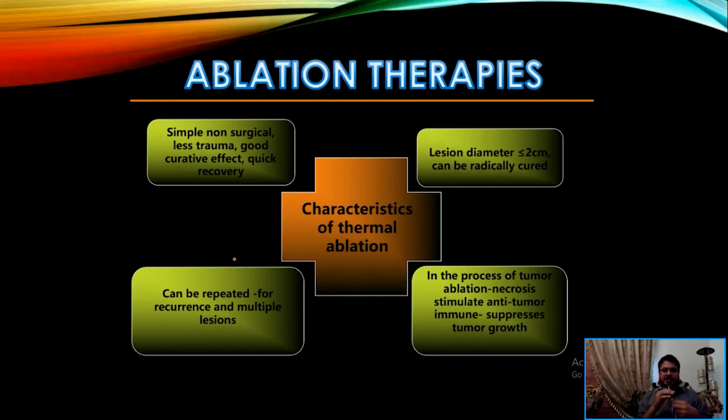So, about ablation therapies, these are very simple procedures in comparison to surgery. Surgical management is more complicated, can take more time of the patient, and can be more cost consuming. Ablation therapies are less traumatic as well, and these are done with curative intent. The recovery is very quick.